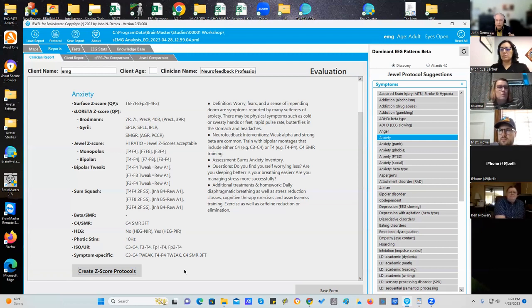And the results were good. And then they went to the bipolar montages for technicians who knew very little, and they were all having success, except it was a little bit slower than the amplitude training. And what the head of the clinic says, well, no, we're just going to do that because the technician will just do it. I don't have to depend on them knowing how to tweak. It'll adjust itself. And so that's their model right now. They're just using those protocols instead of amplitude training.